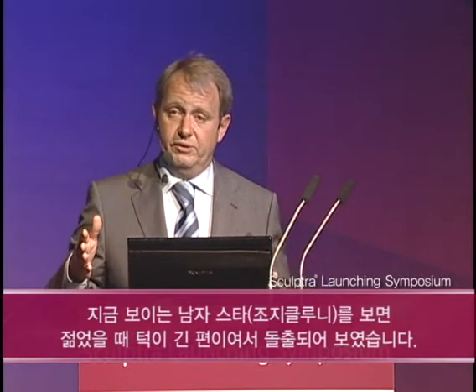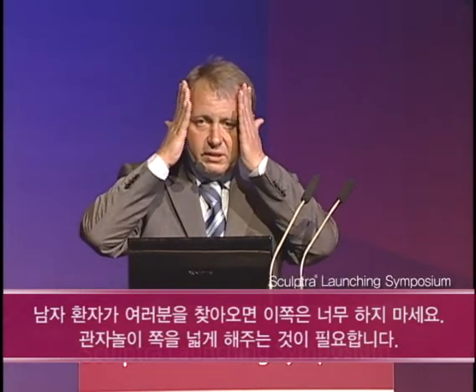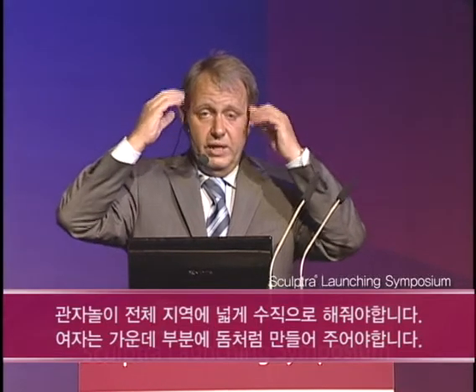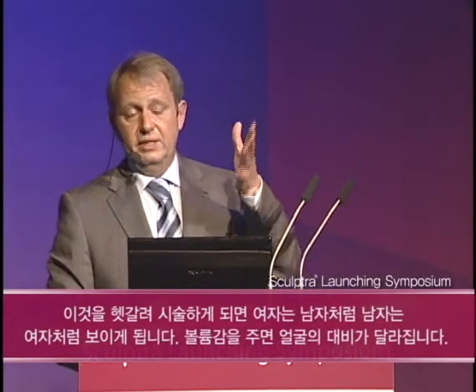A celebrity, typical male pattern of aging: you see he already had kind of a long chin when he was young. He only becomes more prominent. When you get a male patient in your office, don't do too much here. A male needs it in his temples. Widen it out in the whole temple area, from here to here, because it has to stay vertical and wide. In women, where it's hollow, you do it in the center of the temples, you create volume, and you create a dome, a roundness, because that is typical. And if you confuse those two things, then you may make a man look like a woman or a woman look like a man. They will not be satisfied with what you did. That's what I can assure you.